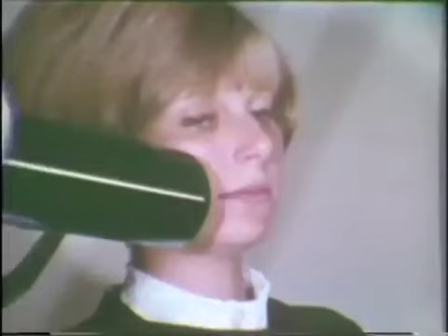The X-ray cone is carefully lowered until the center of the beam is directed at the wing of the film packet. With all alignments checked, the lips are closed and the film is exposed. The X-ray cone is then moved away and the packet is removed from the mouth.